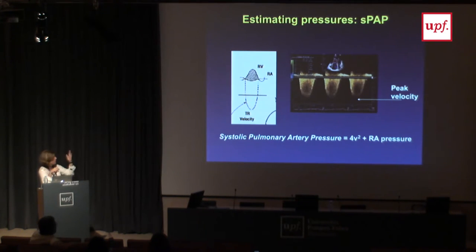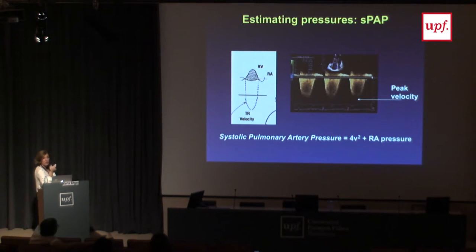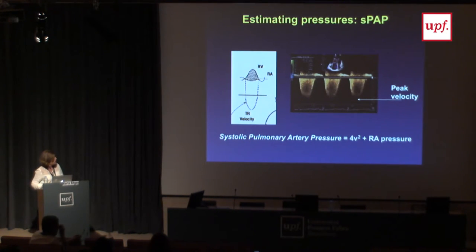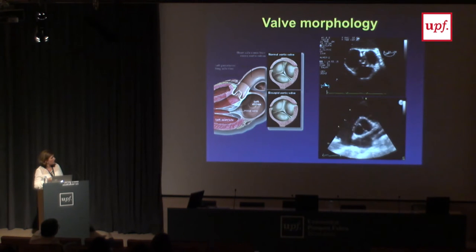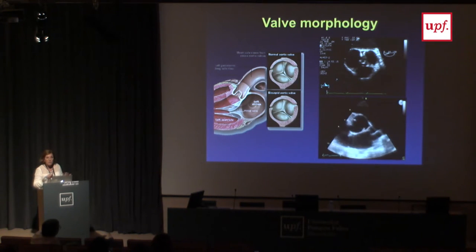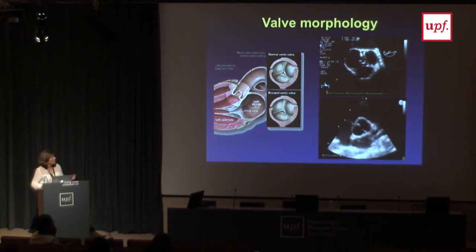We use echo mainly for valve function. We can evaluate morphology — for example, this aortic valve is bicuspid instead of the normal tricuspid. We see how it opens and the flow across it: whether it has high velocities because it is stenotic, or regurgitation seen on color Doppler. This is a mitral valve from a patient with rheumatic fever showing mitral stenosis — one leaflet doesn't move at all, the other is thickened and opens restrictively. Here is another aortic valve cut transversally — it shows a lot of calcium, almost no motion, a very stenotic aortic valve.